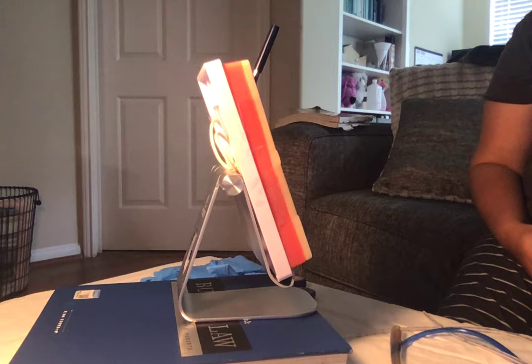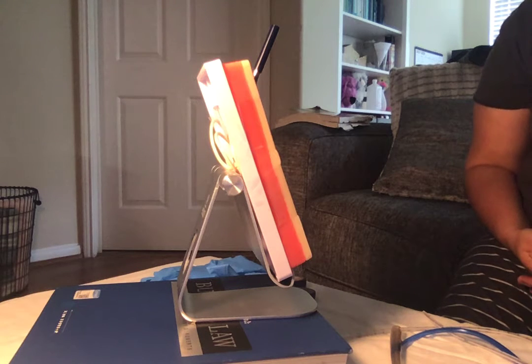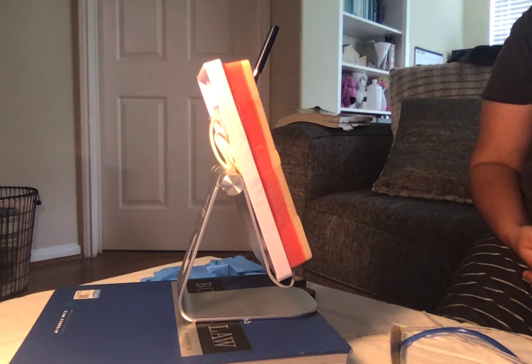This is my NG tube skills video. The first thing I'm going to do is check the medical record for orders, the type of NG tube to be placed, and the tube's purpose. I'm going to review the client history for any conditions that would impair the NG tube going in.